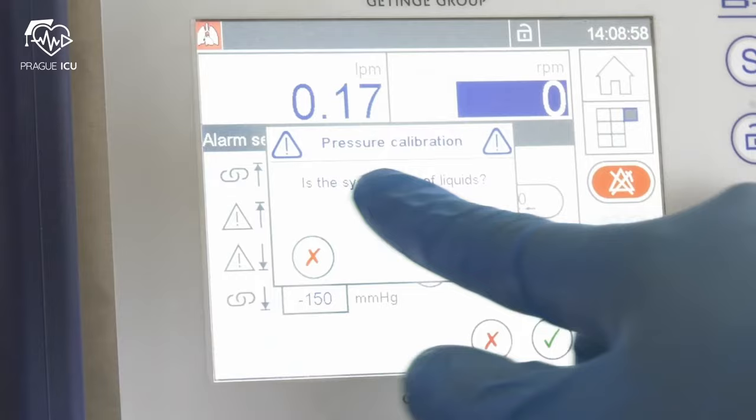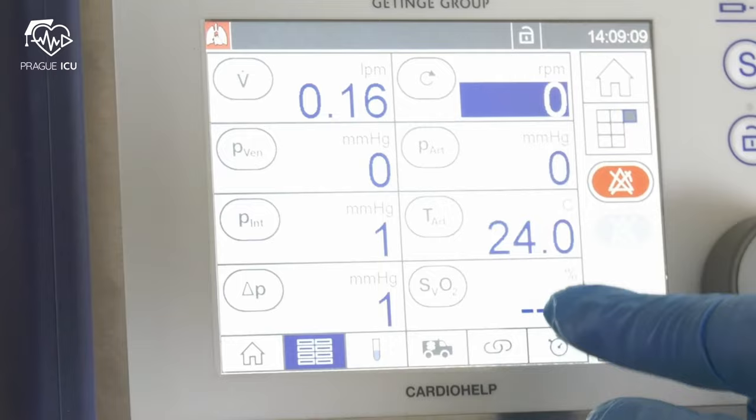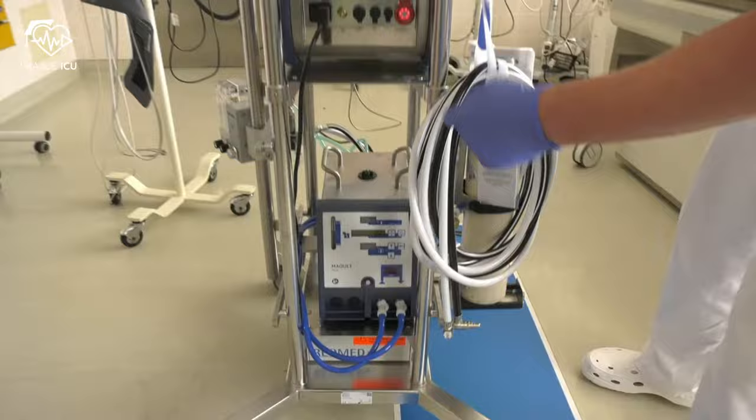Individually calibrate the integrated pressure measurement. The system needs to be free of liquids for calibration of pressure sensors; therefore it needs to be done before priming. We continue with preparing the heater unit.